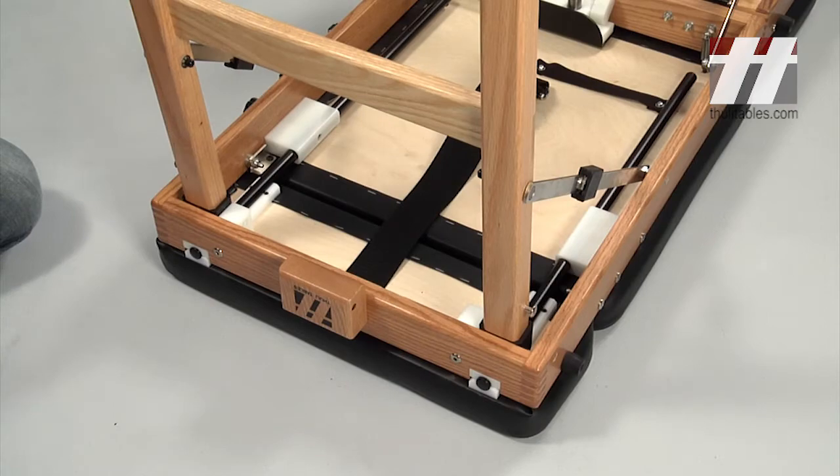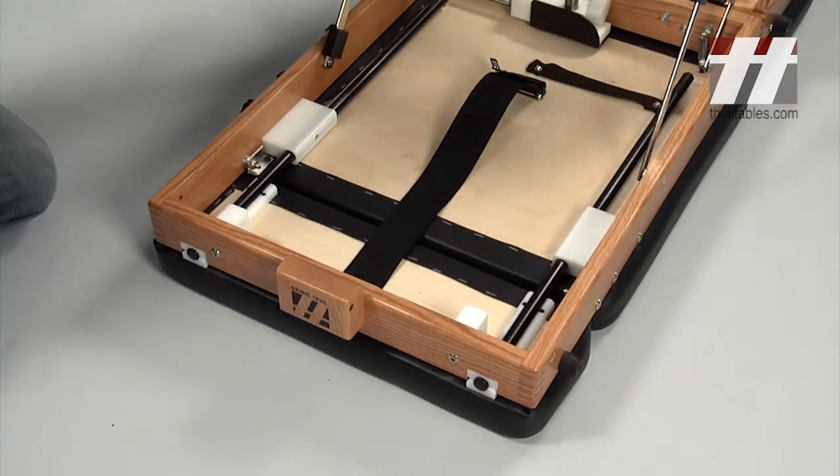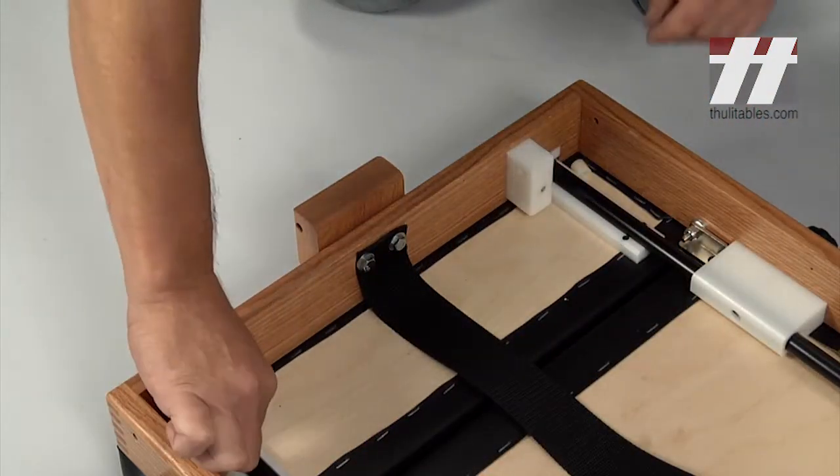Swing the back legs towards the front of the table so that they're out of the way. They will remain attached to the collapsible hinges. Discard the used spacers.